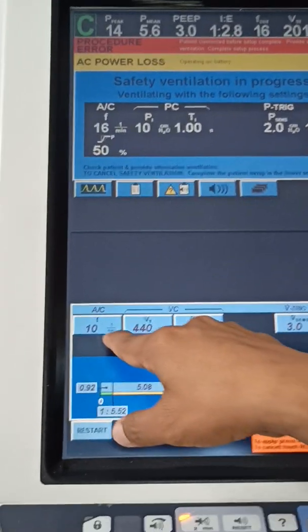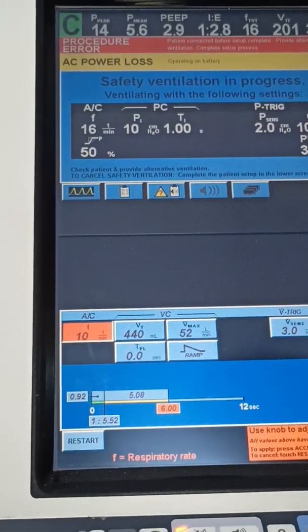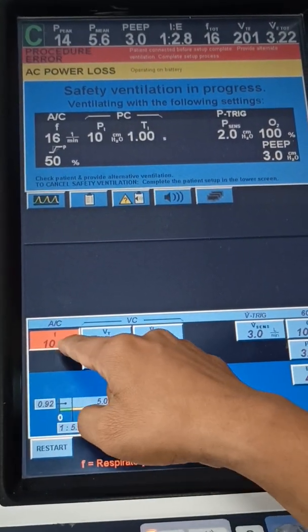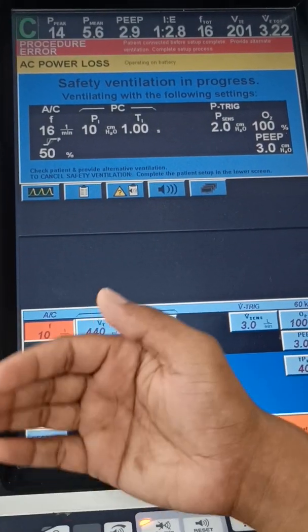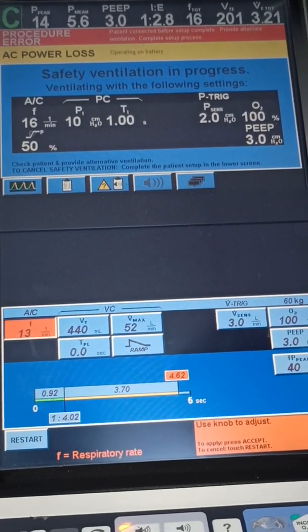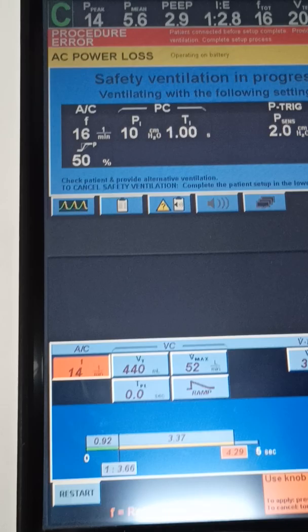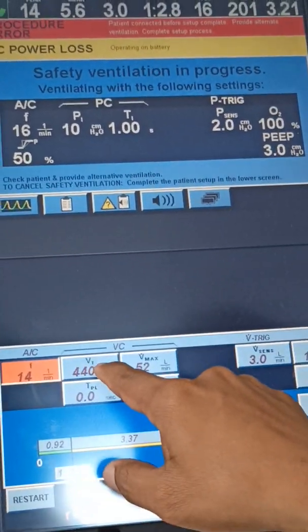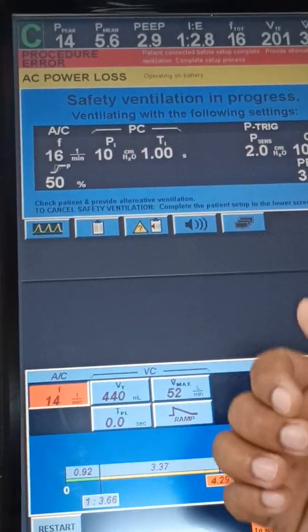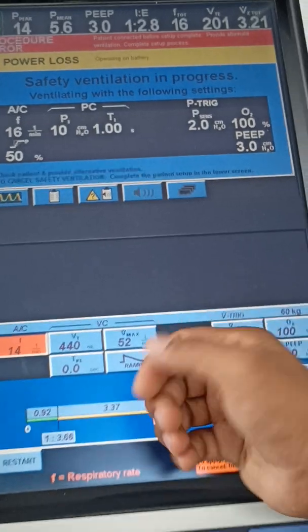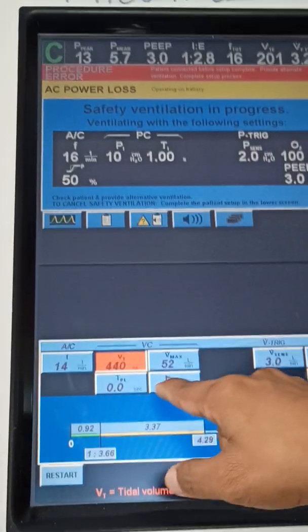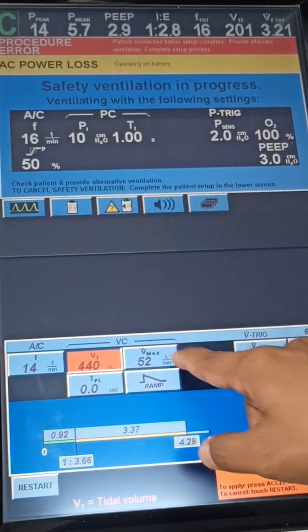If I press continue, you will have options like frequency rate. Rate is usually between 12 to 20 — you will select the frequency depending on the clinical condition. You will keep the respiratory rate on the lower side or higher side depending on the clinical condition. Next is VT, which stands for tidal volume. Tidal volume depends on body weight — usually 4 to 6 ml per kilo. Currently it shows 440, and Vmax is also there.